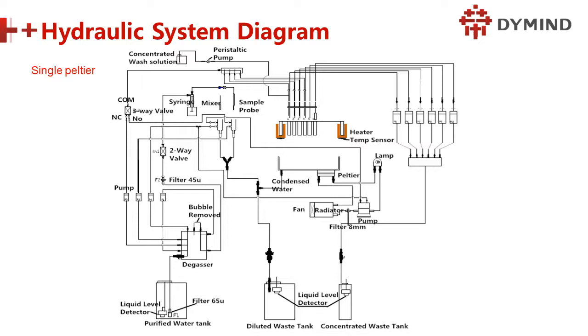Before the sample goes in, before mixing, it's empty, that is only diluent, only pure water, right? And we put the sample, and after we put the reagent, you can see it will change the color of the cuvette. And if we mix, we can get another kind of signal. That is the light signal, right? So we use the signal to do the calculating to check the concentration of the sample, and then give a report to the machine, right?